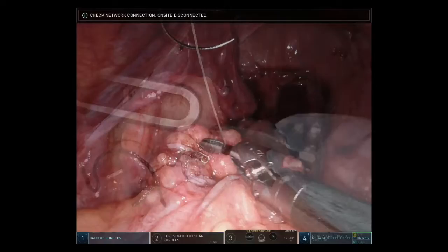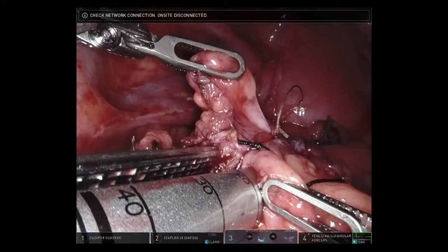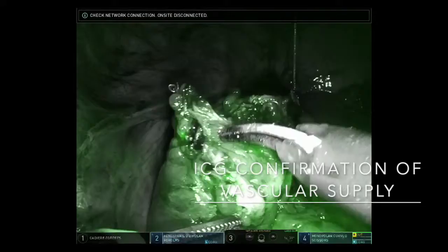Next, we turned our attention to creating the enterotomies in the sigmoid and the rectum to enable the passage of the stapler. Once the openings were wide enough, the two arms of the stapler were passed atraumatically down the limbs of the bowel. By clamping and firing the stapler, a common channel was created between the sigmoid and the rectum. Upon removal of the stapler, we can see the common enterotomy that remains, which can be closed with the barbed suture.